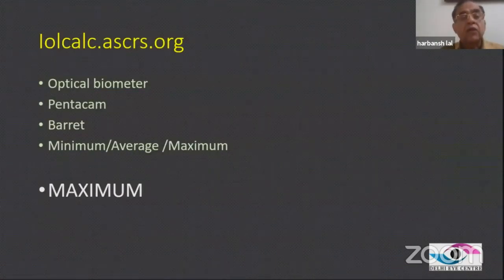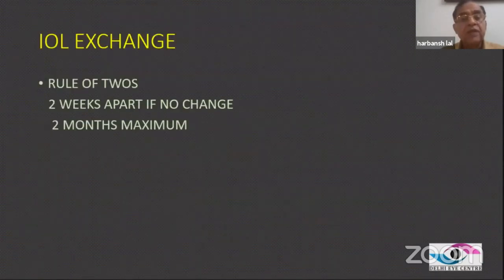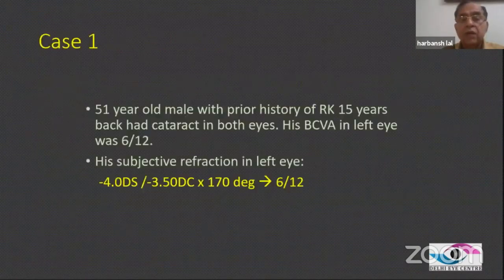So we calculate an IOL calc at dot ASCRS org, which gives us the optical biometer reading, Pentacam, Barrett, minimum, average and maximum. So toric IOL, whether to use or not, will depend upon the type of data we have got. So operatively, there is not much. I'll come straight away to what power to use. I'll just show you some of the cases.